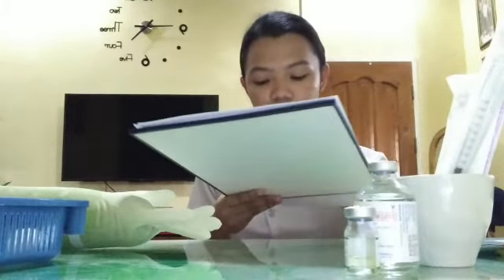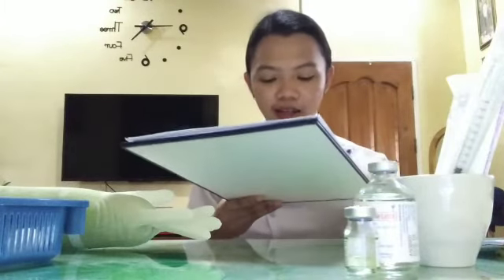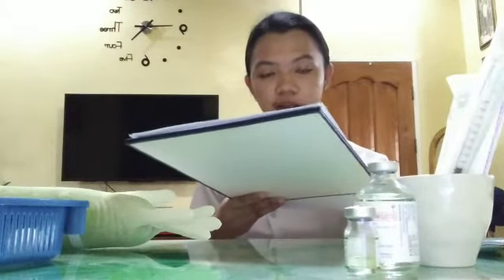So after that, we will note the time. We will note the time of administration, and then the due time, and then the route, or the site rather, of the intradermal injection that we have already administered on the medication. We will write it on the medication ticket. Okay.